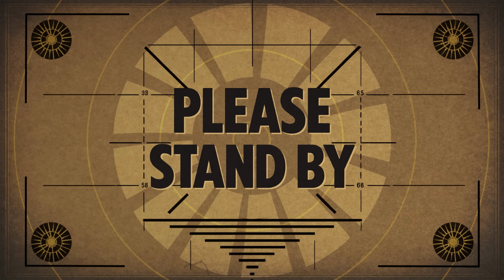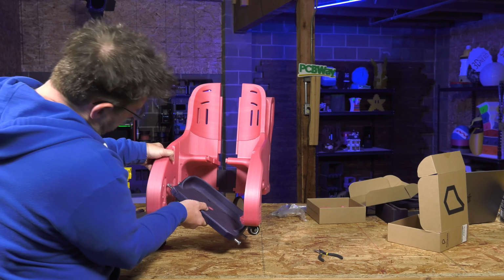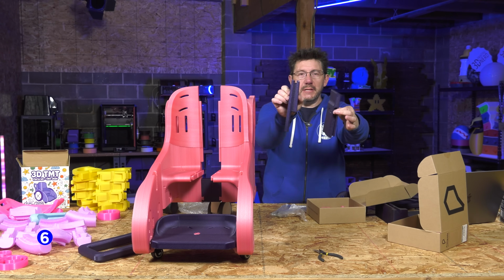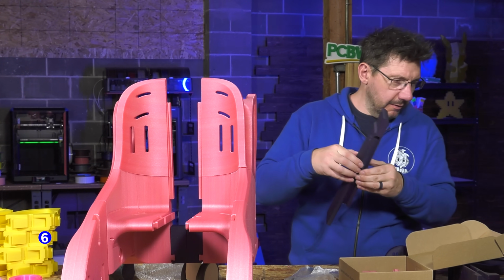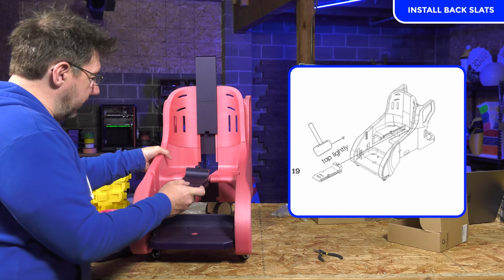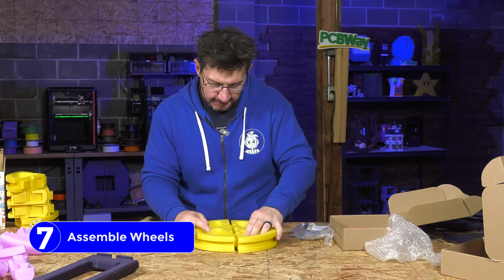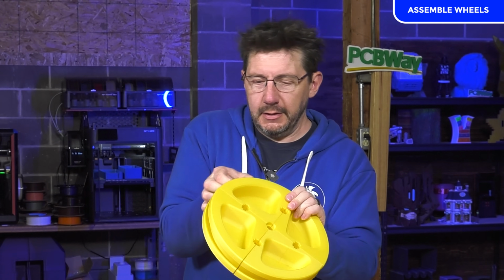So what if you bring it up like this, let's see, how did I do this before? There we go. You have to remember this is plastic. You can bend it a little bit. Next up are these pieces. This one just slots in like that. And these are for the back of the TMT. And just push it down a little bit. And then this piece is gonna slot right in through the front. So if we take these 4, they'll go together like this. Like this. And then you see the holes and everything can lock into place.